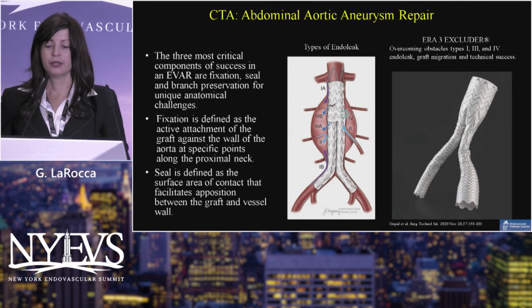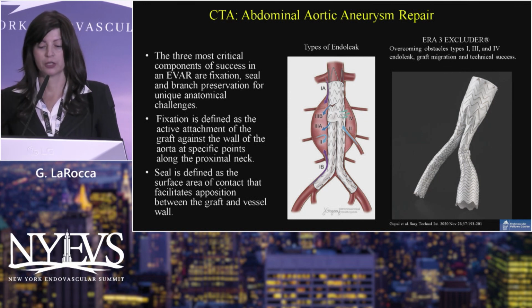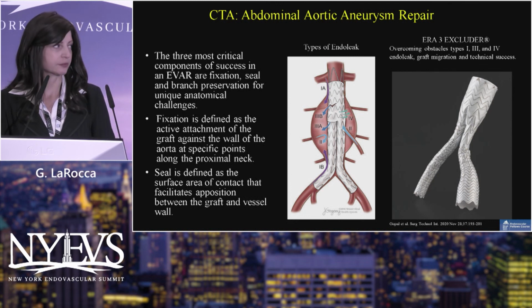Really quickly, we work with our surgeons, cardiovascular surgeons, CT surgeons, vascular surgeons closely, as well as our vascular lab and the cath lab. And once these devices are deployed, we really want to look for endoleak. There are many different types of endoleak. Most people are just concerned about whether or not endoleak is present.